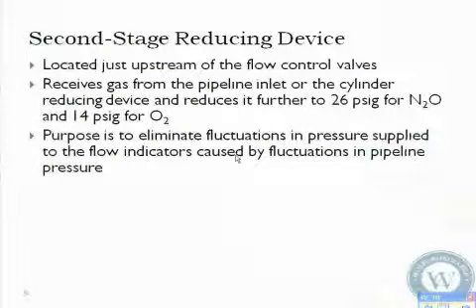All right. Our anesthesia tech may be able to replace it, but we don't have the tools to replace it inside the OR. Okay? So know your pressures here. To go from intermediate to low, all intermediate pressure is 50. Now we're moving to our low pressure, and I just showed you that.